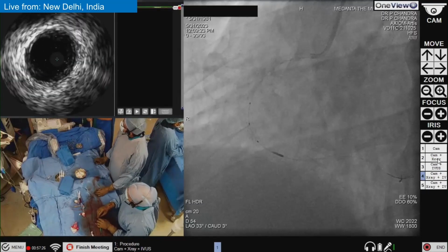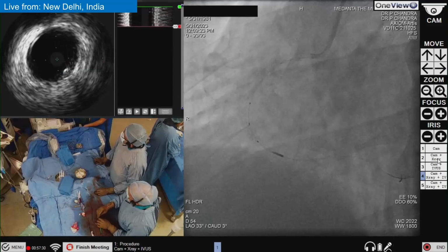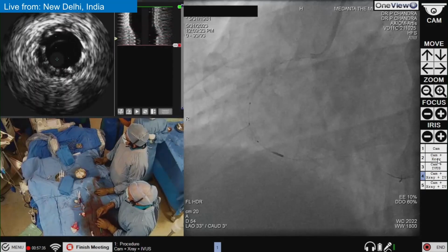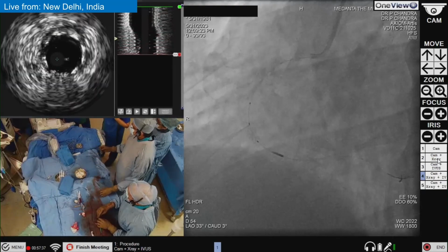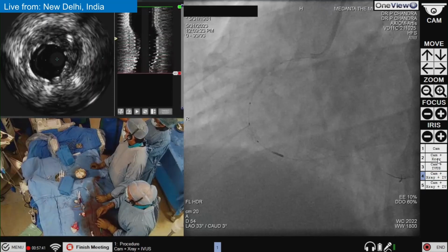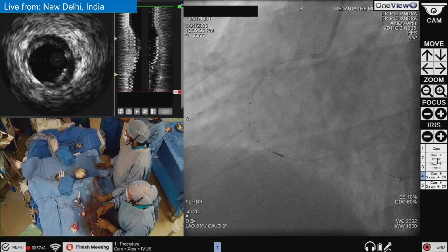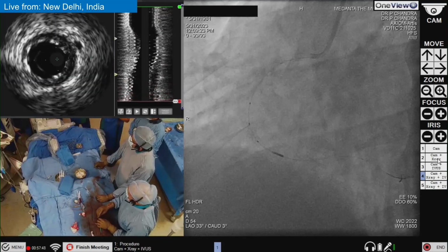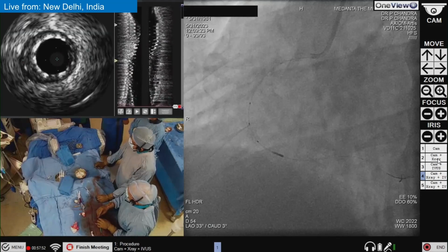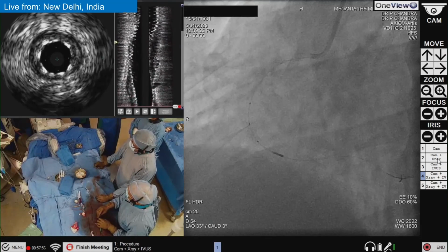Yeah, so now we are in the distal part, just distal to the stent, so you can tell what we see. So you can see the vessel is quite normal at this point. The stent is very well opposed. Maybe we can go 1 mm post dilatation more. So we can go 3.5 high pressure, and here also it is not fully dilated. There is some under expansion. There is no malapposition. So the proximal and distal edges are looking fine. So I think we can use same 3.5 balloon at high pressures, or because 4 will be slightly bigger for this.